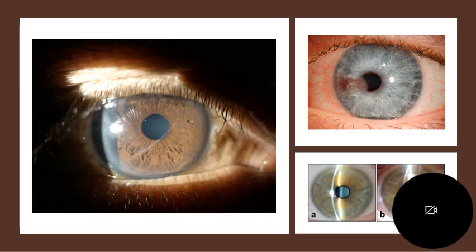This is an example of the different ways in which the slit beam can be used to illuminate the eye, with different ways of manipulating the light to be able to pick up different problems. On the left-hand side, you see a wider beam that is focused on the sclera and the cornea. Could you pick up any problems in this eye that we see? Anything different that is not supposed to be there?